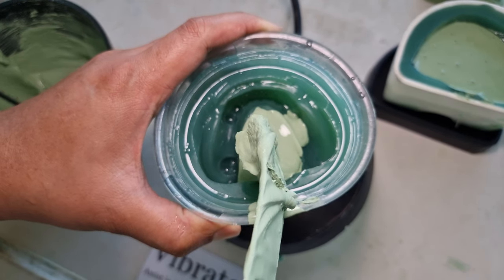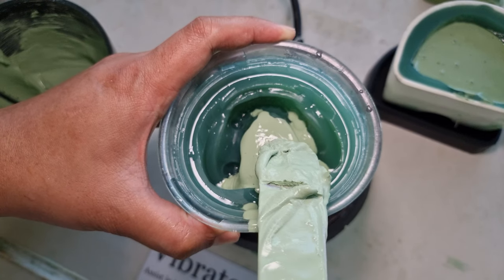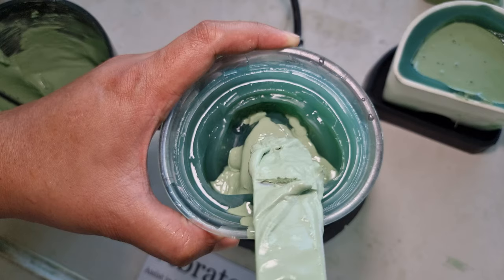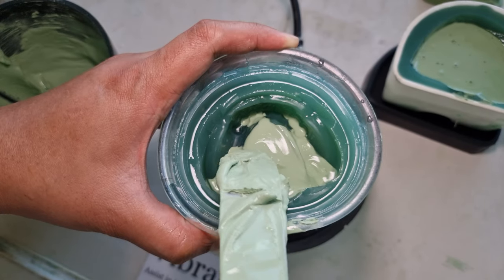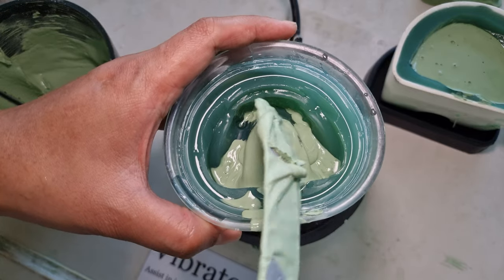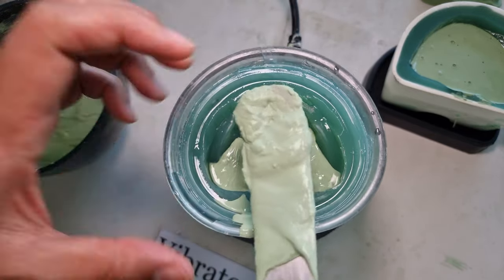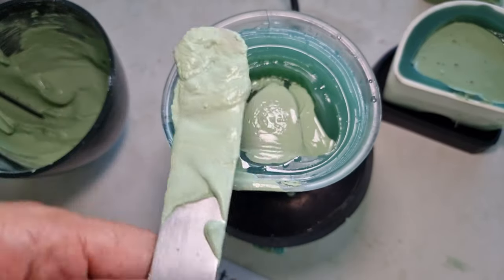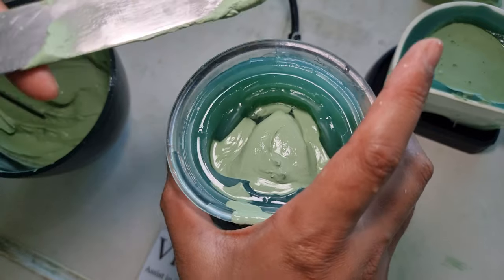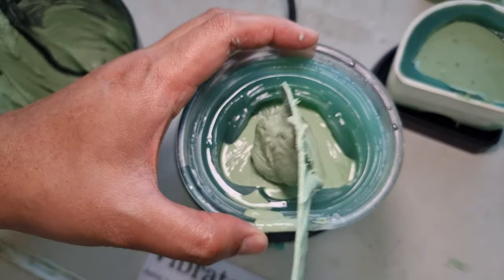Make sure you put it beside the teeth. Do not put it on the teeth because bubbles might get trapped on the teeth surface. It's harder for the bubbles to flow out, and the stone covers the bubble in the air and the teeth. In this area.